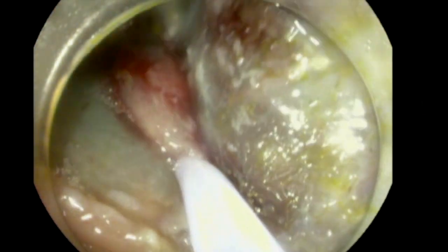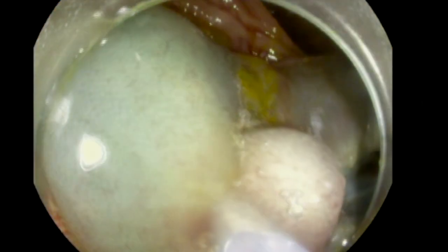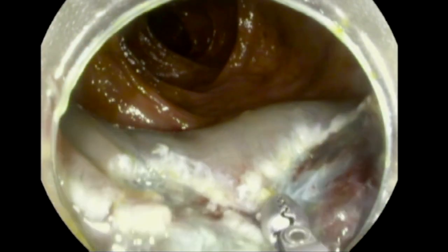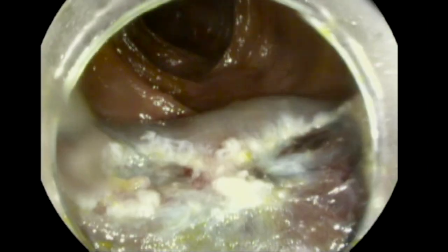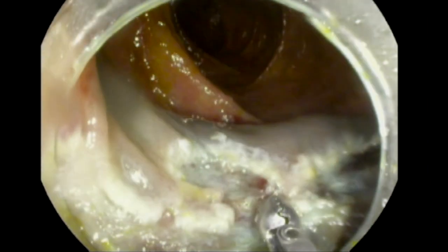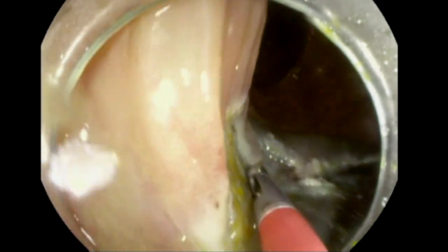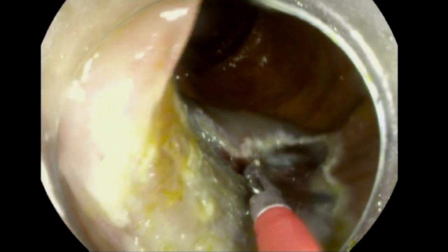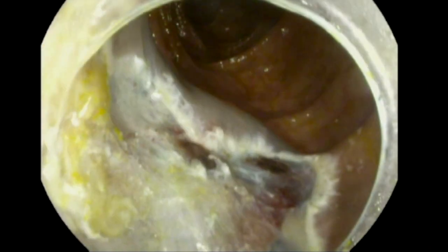You can notice that in spite of our good effort in injecting and raising the lesion, there is some degree of fibrosis and residual tissue. Now we're going to use hot biopsy forceps with soft coagulation current — and I'm stressing again, soft coagulation Effect 5, 50 watts — to remove whatever residual tissue is left. Some people also use APC; both post-resection techniques are fine. And that is the final image after EMR of the region. Thank you.